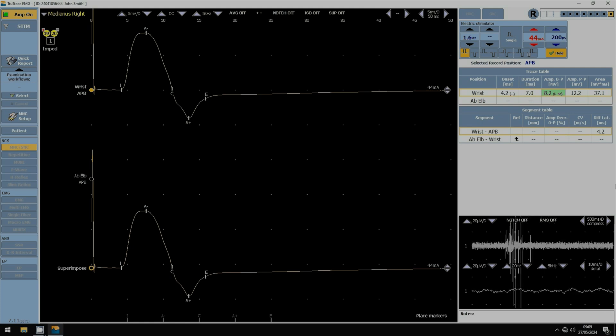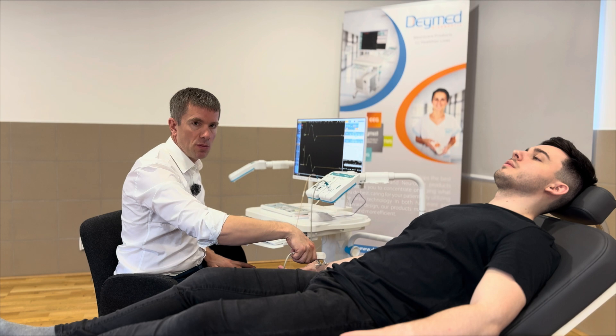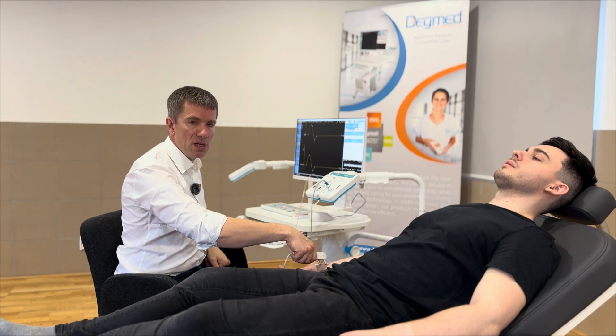On the screen the sensitivity right now is 5 mV per division. The sweep overall is 50 ms. By turning this dial we can change the sensitivity. Take care that the sensitivity for the proximal and distal stimulation will be the same.